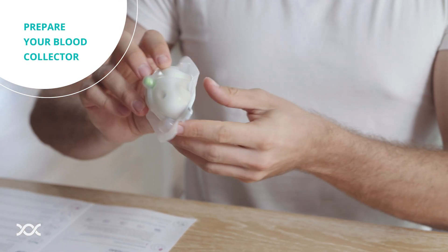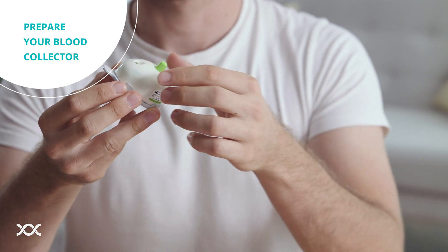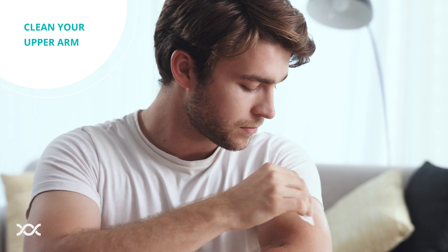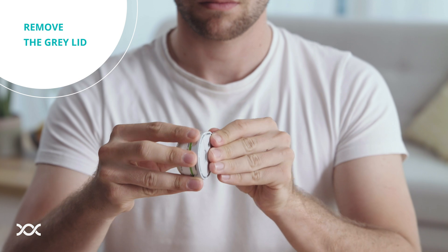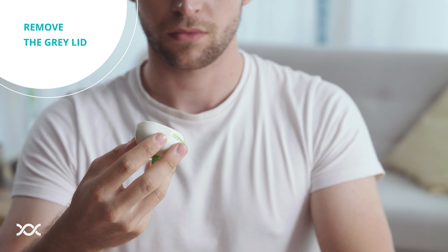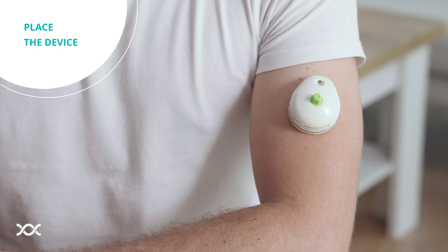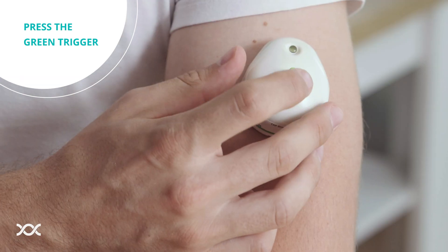Take the blood collector out of the silver foil bag. Discard the silver foil bag, but keep the plastic shell for later shipping. Take the alcohol swab from its wrapper and thoroughly wipe the least hairy part of the upper arm. Allow the cleaned area to dry for 30 seconds. Remove the gray lid from the bottom of the blood collector and throw it away. Make sure that you do not touch the sticky underside of the device. Press the device firmly to the outside of your upper arm. There is no need to hold it during the blood collection. To start the collection, press the green trigger.